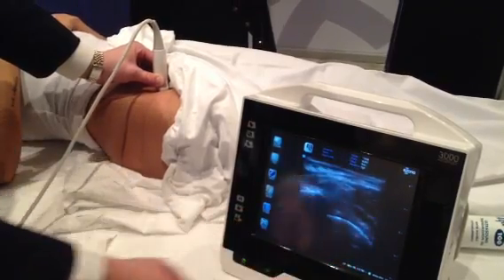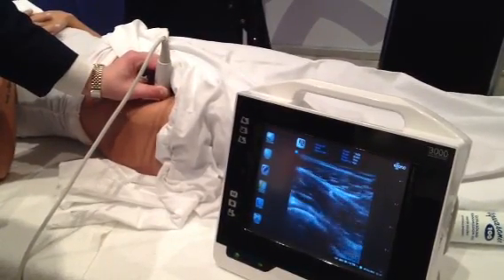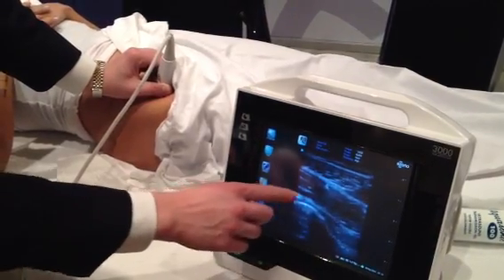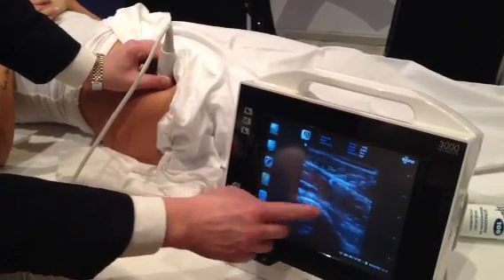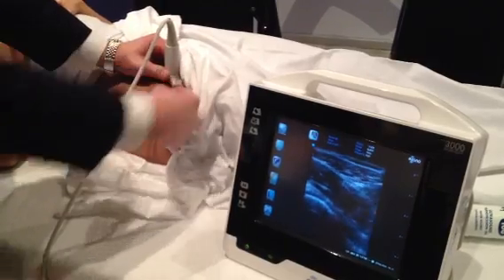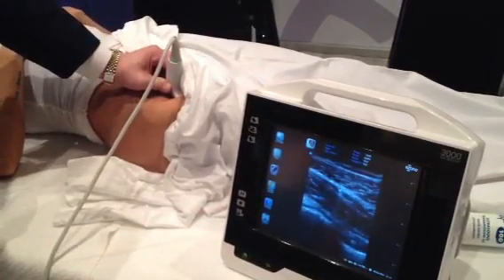I see the femoral head here, so the neck is over here, and I'm going to take my probe and go towards the troc. Here is the ligament coming off the head, here's the neck of the femur, and you start seeing it go into the head and you see how this pocket opens up nice and big right at this level. Take your needle, come this way so you're going straight on. Your needle should come down right into that area and you have a very nice intra-articular hip injection under ultrasound.